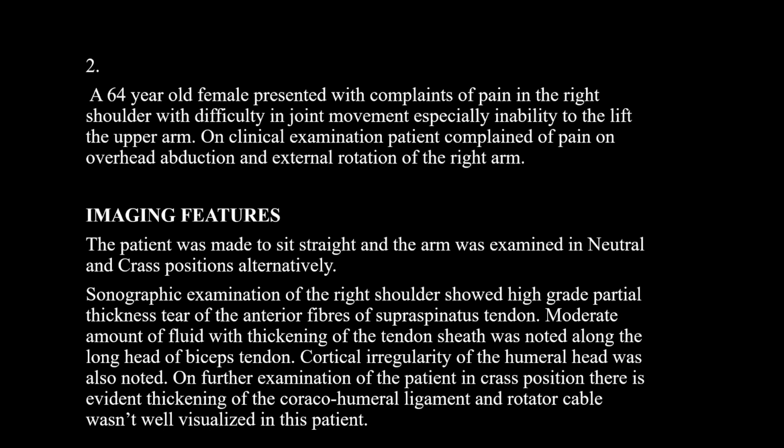Case 2: a 64-year-old female presented with complaints of pain in the right shoulder with difficulty in movement, especially inability to lift the upper arm. On clinical examination, the patient complained of pain on overhead abduction and external rotation of the right shoulder.